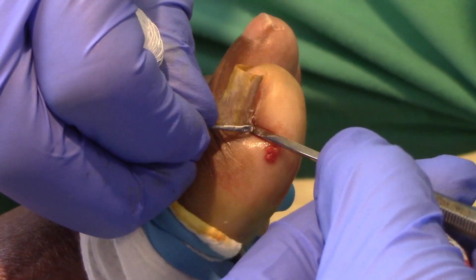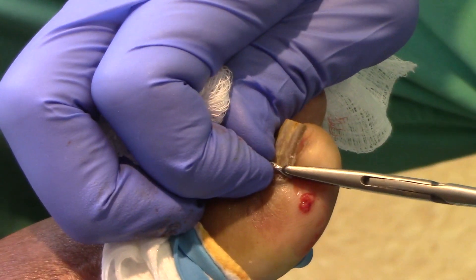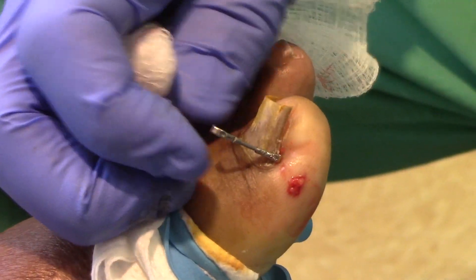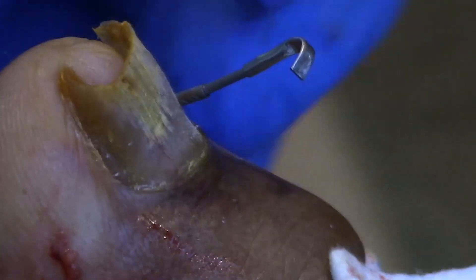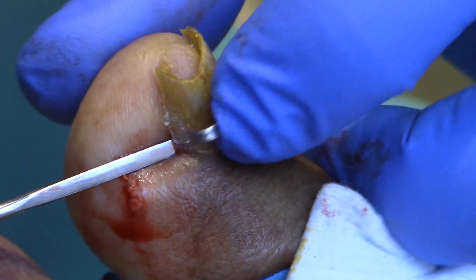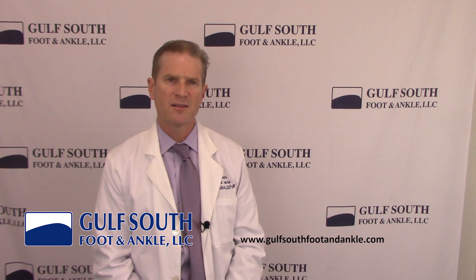One side of the KD device is then hooked under the nail plate at this site. Once in position, the KD device is then crimped down with a hemostat or needle driver to secure it to the nail plate. With one side attached, the KD device is manually pressed down over the top of the toenail to bring the opposite side into contact with the other nail border. Using the same securing technique, the other side of the KD device is fastened to the opposite nail border.